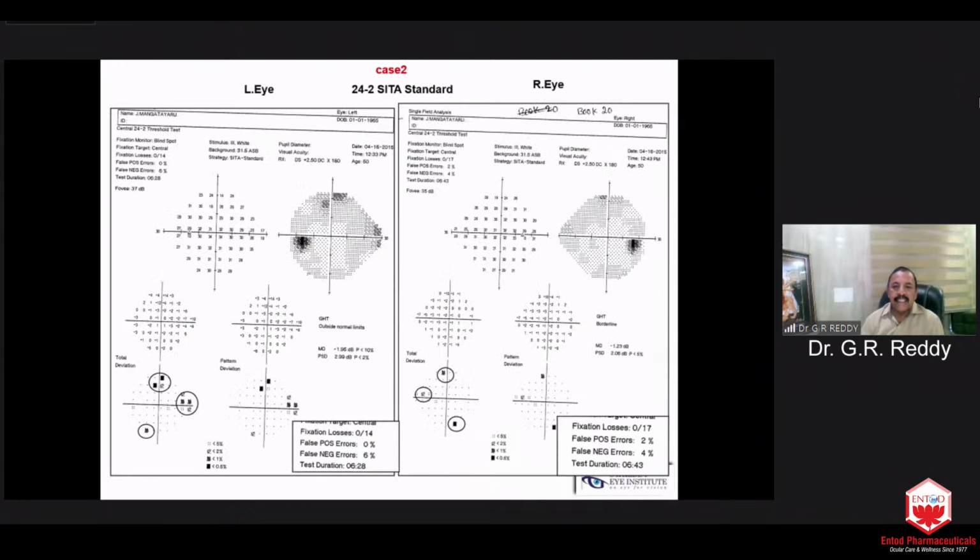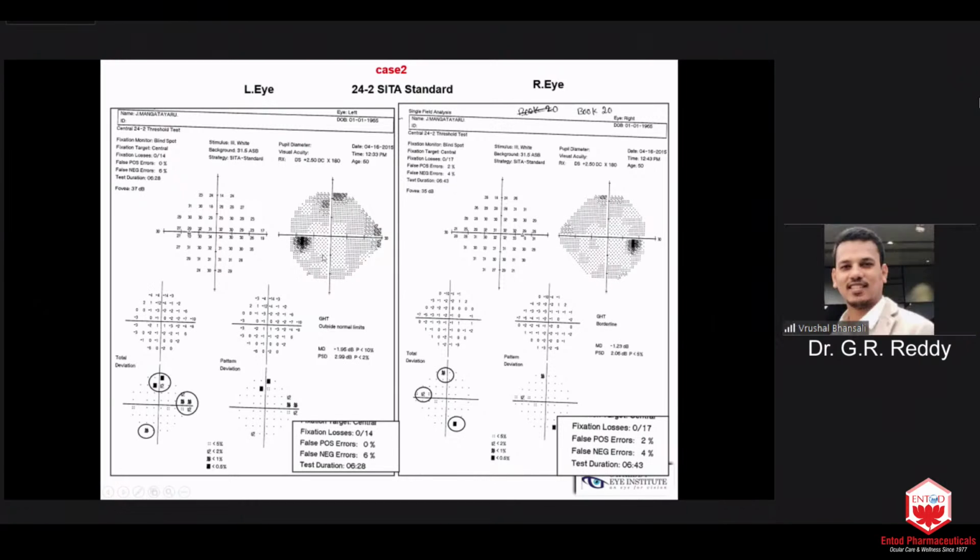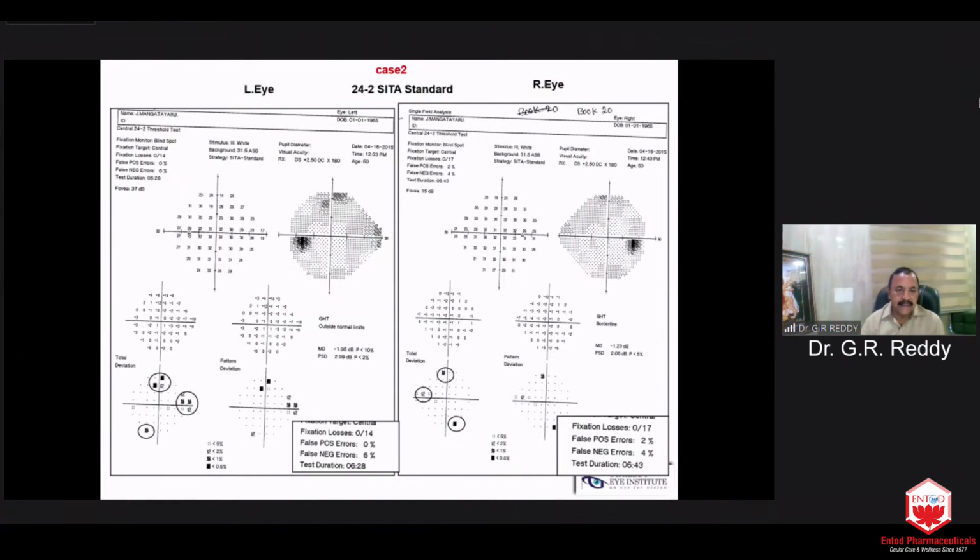And when you are suspecting glaucoma on the basis of the disparity of the cups of both eyes, hold the printouts, the right eye printout with the right hand and the left eye printout with the left hand, and interpret the visual field simultaneously as in neurological cases. And if you see this, the nasal step, here the nasal step, and here a scotoma on the temporal side and then the nasal side.